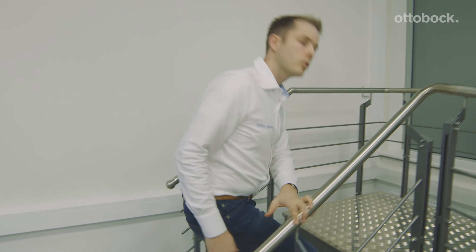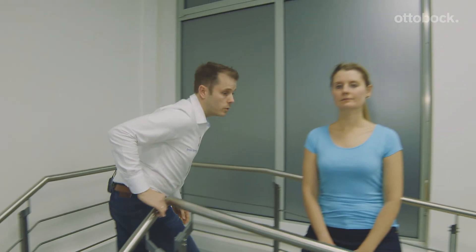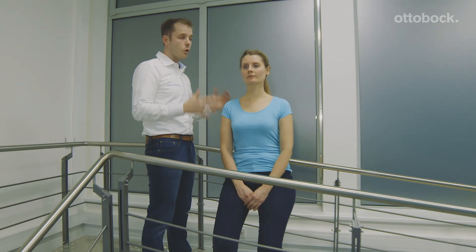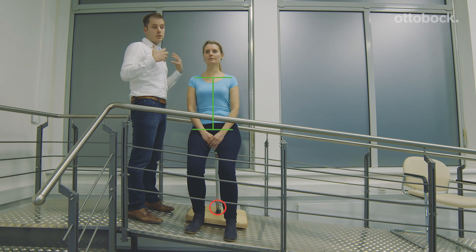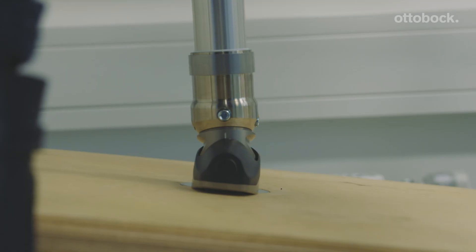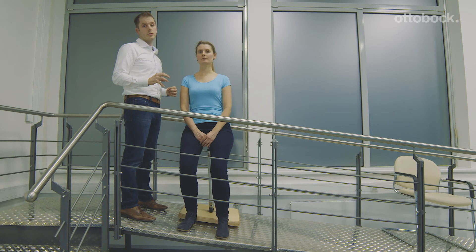Thanks to the ML unit on top of the Triton, end users really feel more stability, more security, and even less stress in the sockets. And if we go back to the first situation, the face still looks perfect. And if you see the complete picture now, you can see there is no compensation anymore in the body. The ML unit is taking out the compensation, and this is really highly beneficial for the end user.